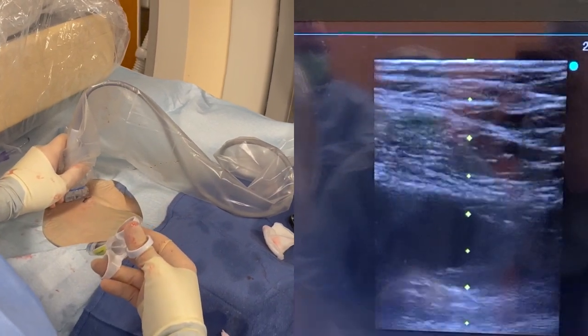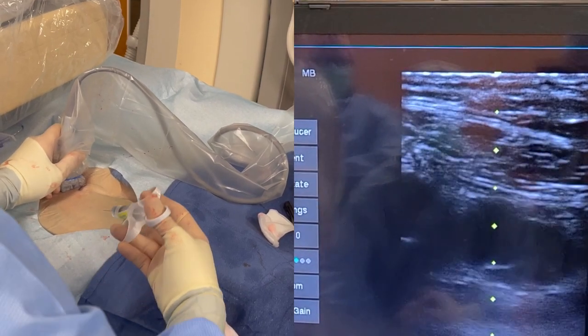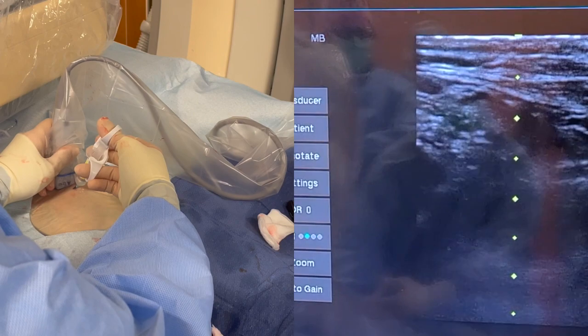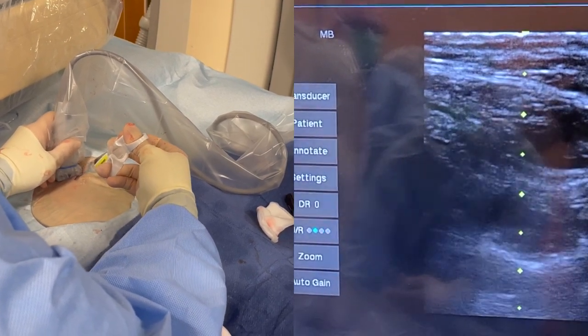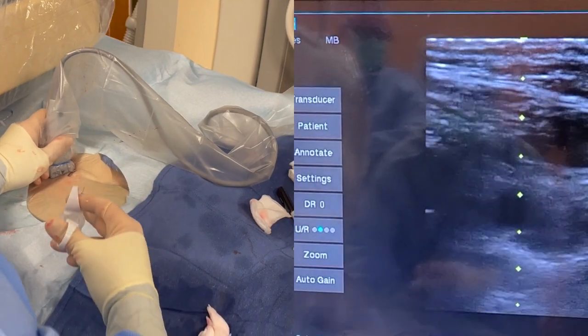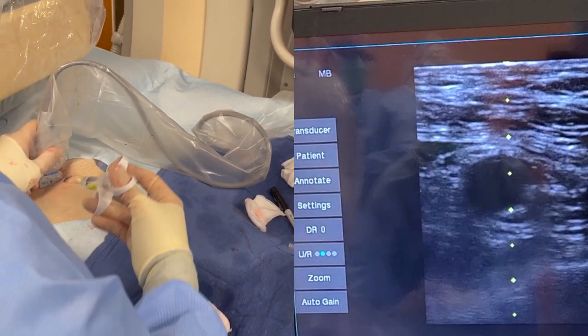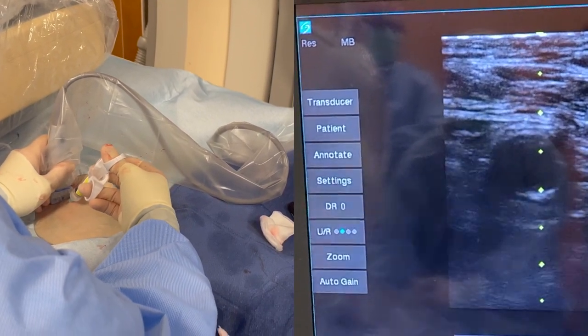Once I anesthetize the skin, I appreciate where the vein is, which should be easily collapsible. As I said, too much pressure will make entry into the vein difficult. Here I am anesthetizing around the vein. After that, I anesthetize around the artery, and this appears to be a desirable part of the artery to enter.